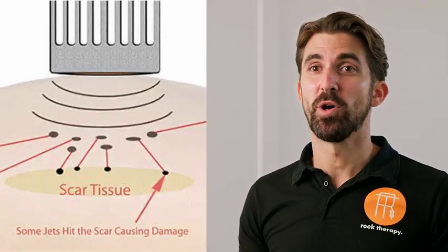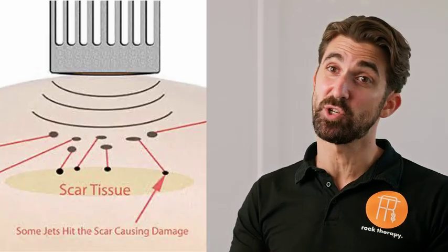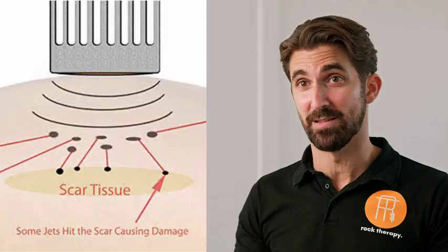The key is, what is cavitation? This is the process of vapor bubble formation and subsequent collapse that occurs within the tissues where shockwave therapy is being applied. Sudden changes in pressure locally cause the formation of vapor bubbles within tissues. These bubbles then implode and create a microjet and shockwave, which in turn creates very focused and controlled local damage.